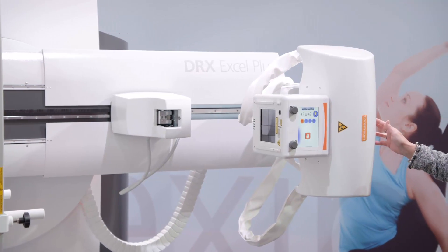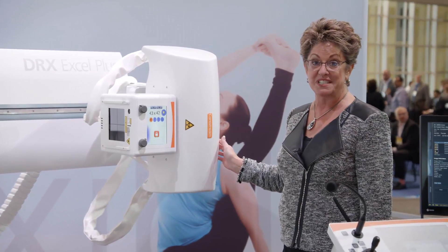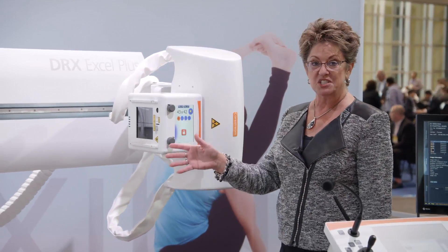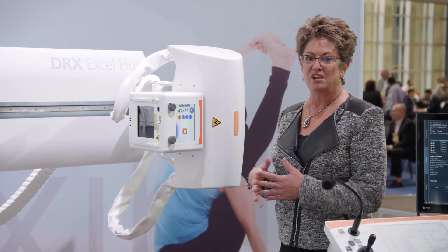One of the most unique features of the XL Plus is the ability to get a 72 inch source to image distance. Now we're not limited — we can do chest x-rays, we can do cervical spines, we can do upright knees all in the same room.